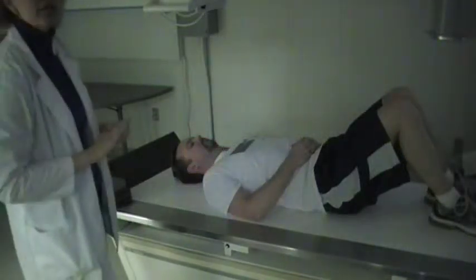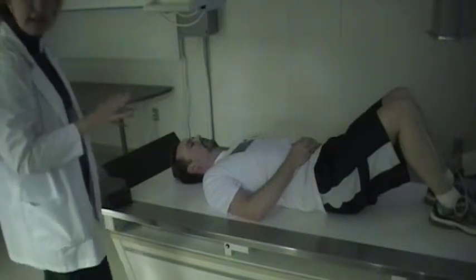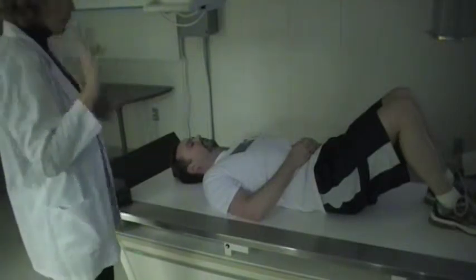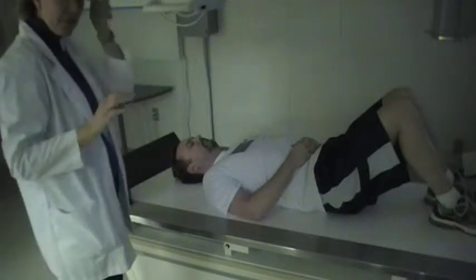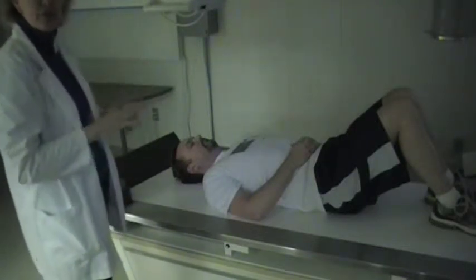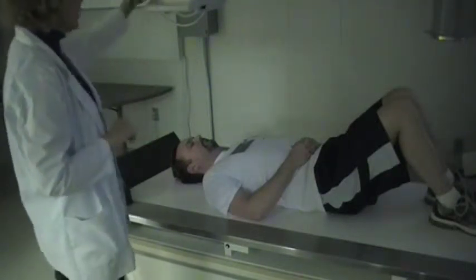Now I'm going to show you how to do a cervical spine on the table. If you have a trauma patient, they're not going to be able to stand up for the rest of their images, so you're going to have to do it with them lying on the table.